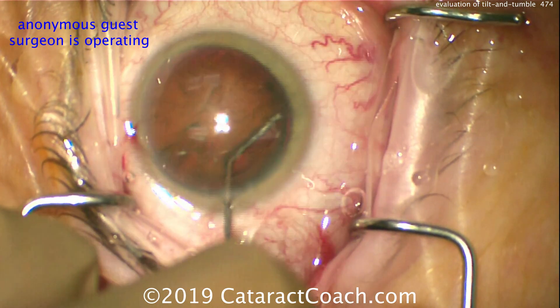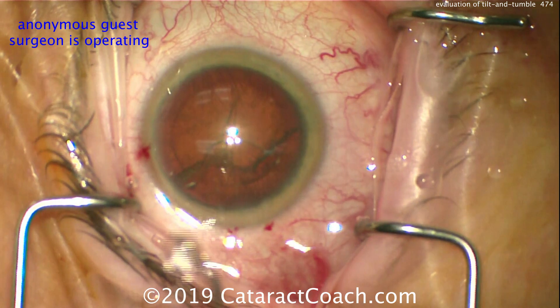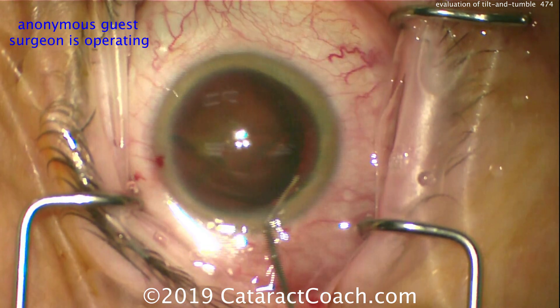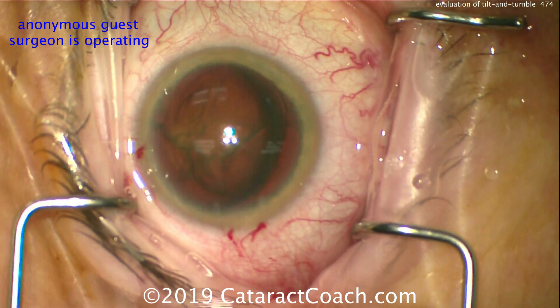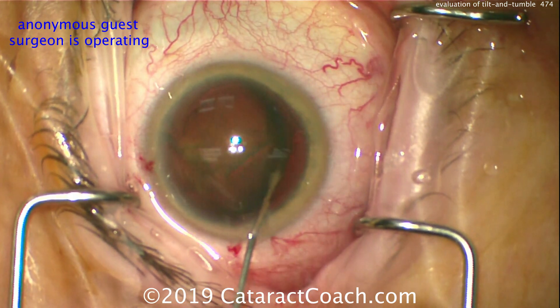So here's some hydrodissection, good fluid wave going behind. And let's go in an opposite direction — this doctor is going to do a little more hydrodissection. There's the nucleus partially out of the bag, and you can help lift the nucleus as well, as done there. This is a classic tilt and tumble technique as described by Dr. Lindstrom many years ago.